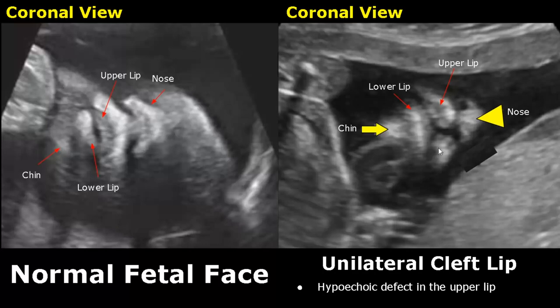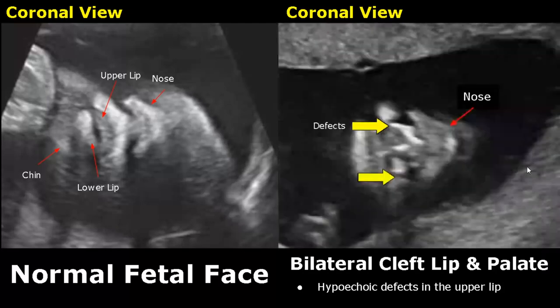Cleft lip and palate is a common facial abnormality in neonates. These clefts can be unilateral or bilateral. In this image, we have a unilateral cleft lip — there is a hypoechoic defect in the upper lip. In bilateral cleft lip and palate, two hypoechoic defects can be seen in the upper lip.